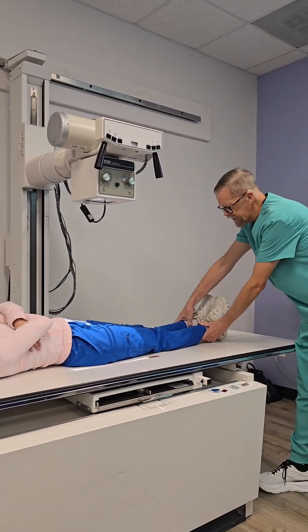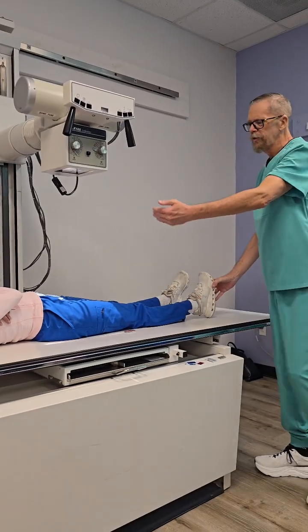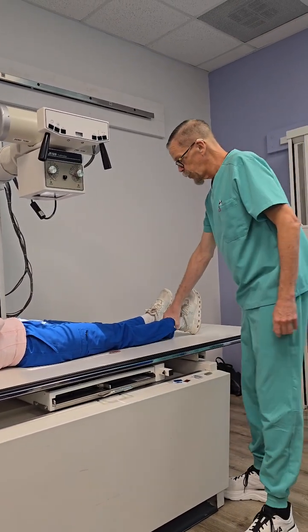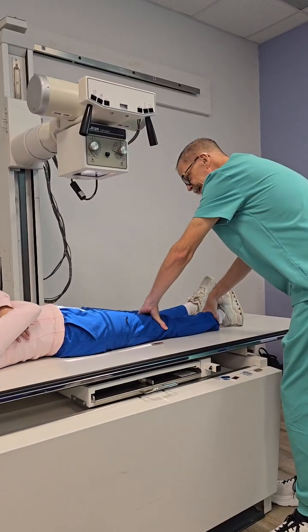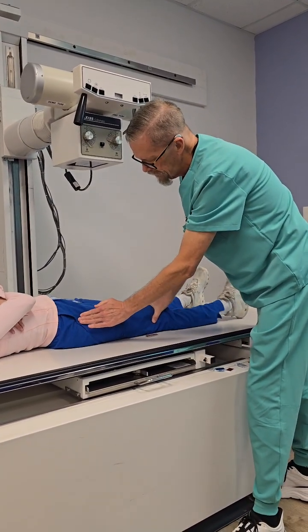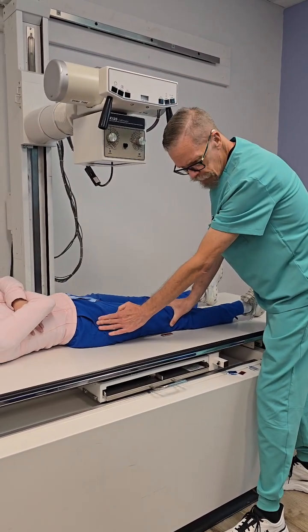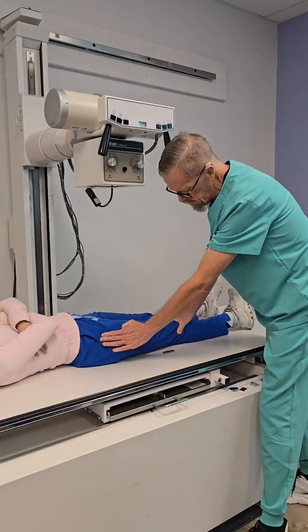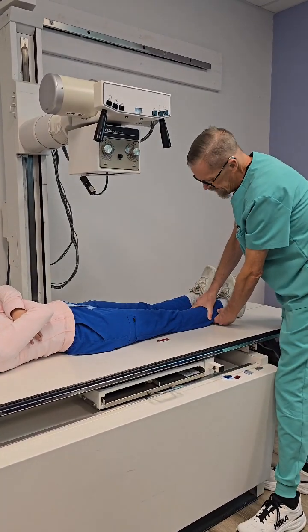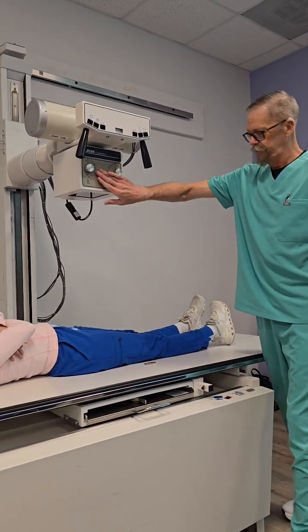We are going to separate the legs a little bit, just so we don't get too much of the other one. And we're going to rotate how much in for the proximal? 15 degrees. So we're going to abduct this a little bit and rotate it in. Right here I can feel the greater trochanter. When I rotate the leg inward, now it's popping out and saying hello. Even though her foot's more than 15 degrees rotated, I can tell that her leg isn't.